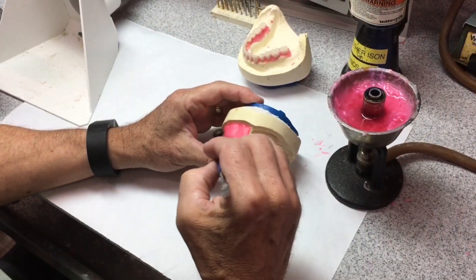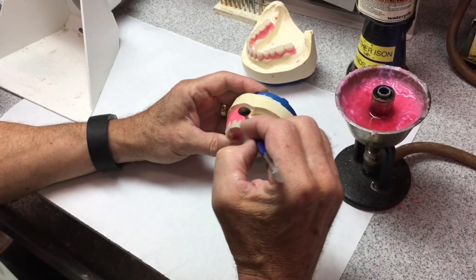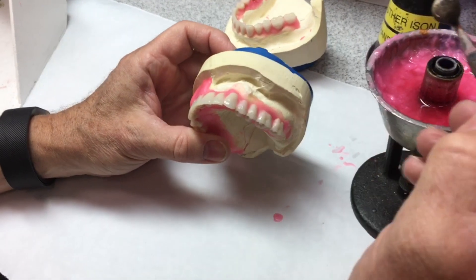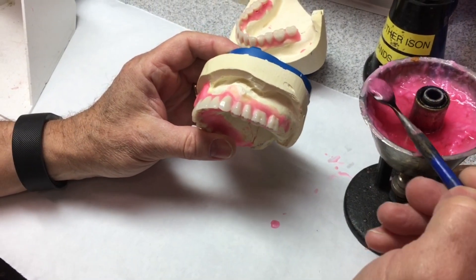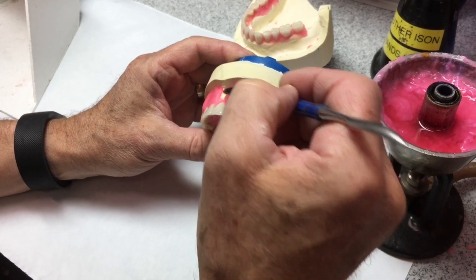This is an immediate denture. I've already added wax onto the patient's right side. I just want to go ahead and quickly add some of this melted wax so I have something to festoon.